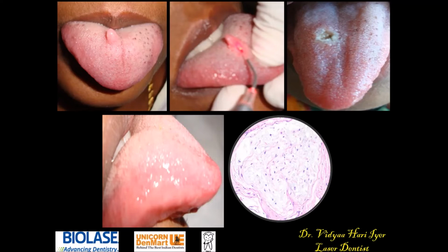At the same time, you're getting a surgical procedure without the basic need of a surgery. So when I say surgical, I definitely mean that, you get a treatment program done. And this program does not mean that you're going to see blood or pain or anything like that. So we use the word surgical only because it is a removal of a tissue from your body.